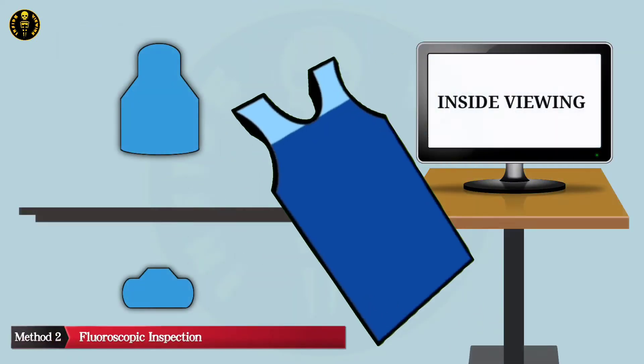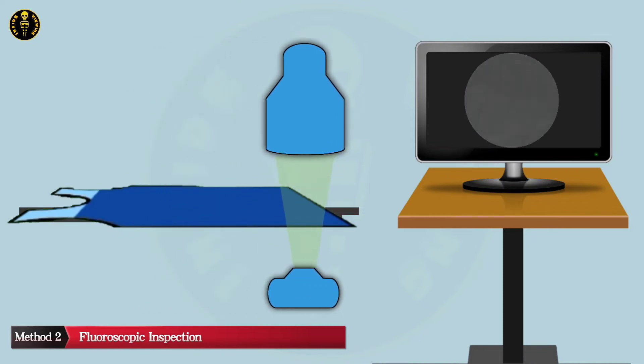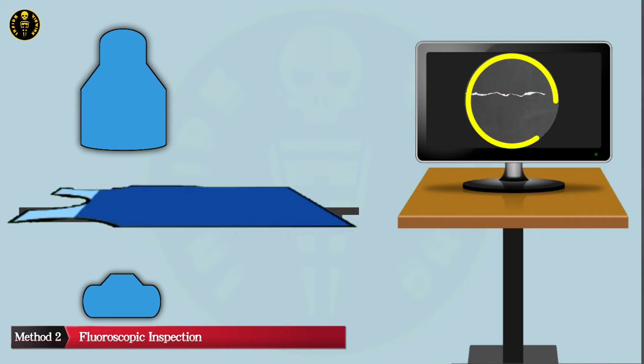For fluoroscopic inspection, lay out the apron on the fluoroscopy table and inspect the entire area fluoroscopically by applying high kVp and low mAs.